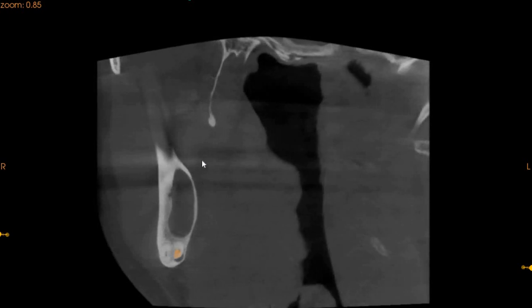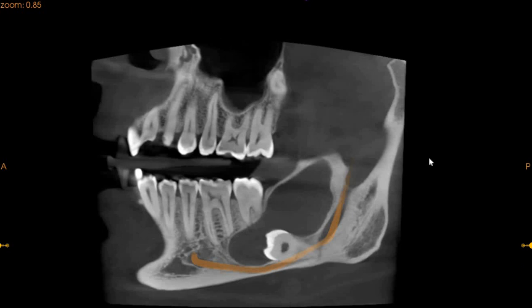We will give you a differential diagnosis. This could most likely be a dentigerous cyst, an odontogenic keratocyst, or a fibro-osseous cyst. So these are the 3 differential diagnoses we have. Further investigation and a biopsy is definitely advised in this case.